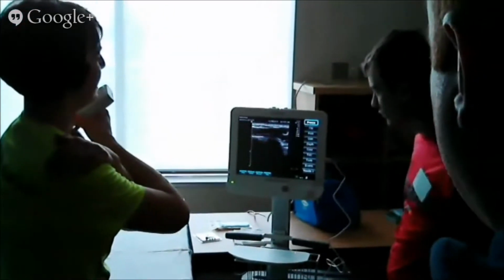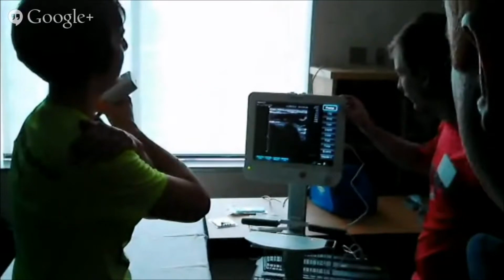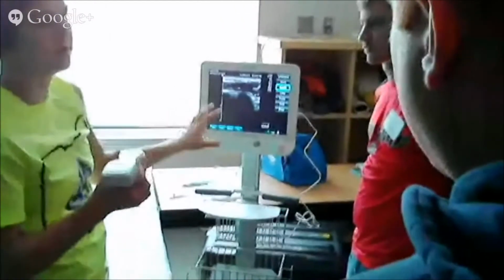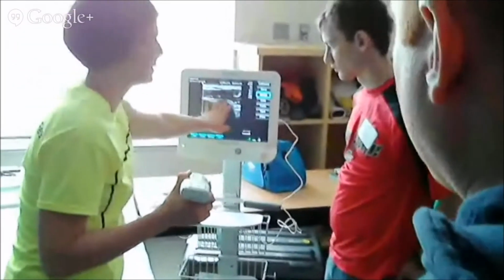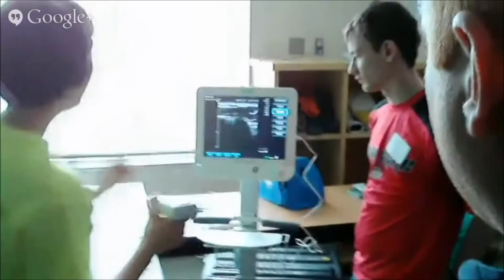On the right side of the screen, here's the AC joint. It's not a perfect image because I'm a little bit off of 90 degrees, so you're not seeing the perfect surface with the white surface. But as far as the AC joint, it's a little bit of a V between.